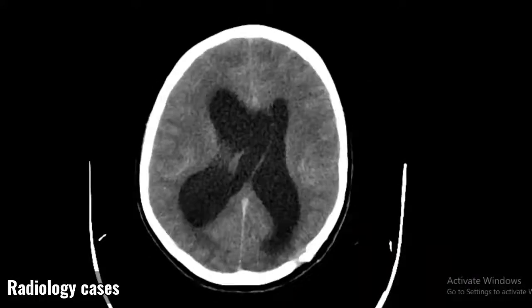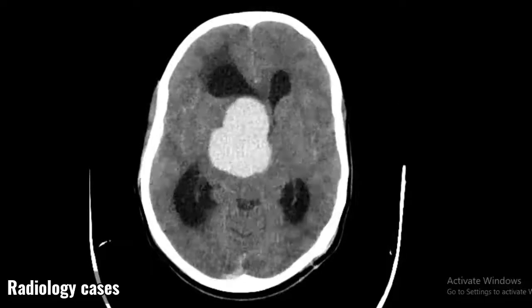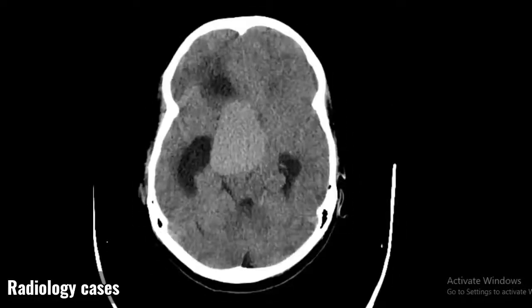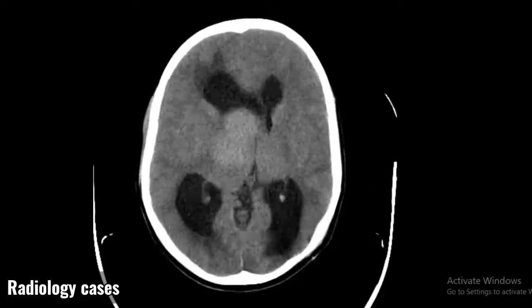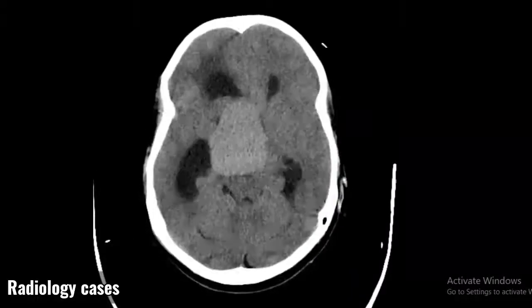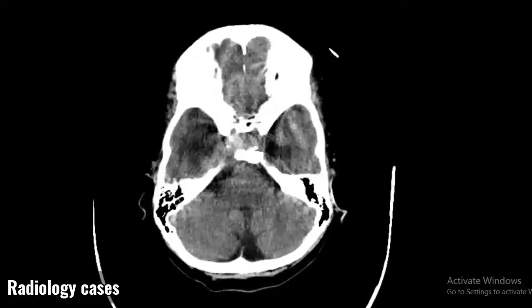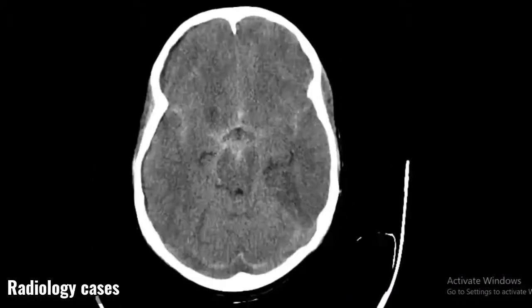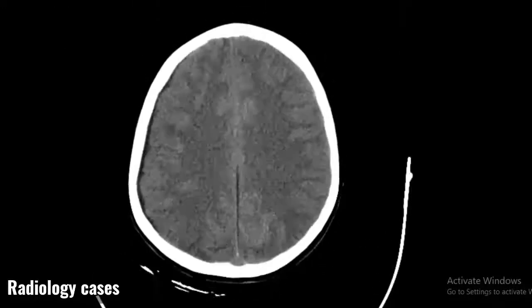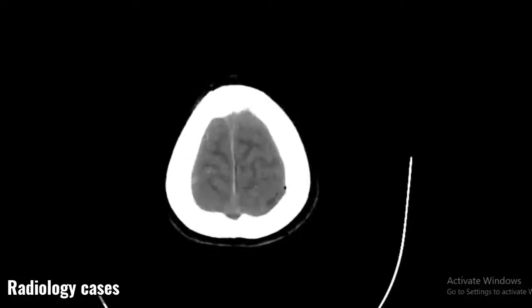There is also extension of the mass to the parasellar structures. No sign of adjacent organs invasion. No skull base lytic or sclerotic bone lesion seen. No calcification detected. There is moderate obstructive dilatation of the lateral ventricles of the brain with effaced sulci and cisternal spaces. The right eye globe had been surgically removed. The paranasal sinuses and mastoid air cells are clear and well aerated. There is a left occipitoparietal bone post-surgical defect, burr hole.